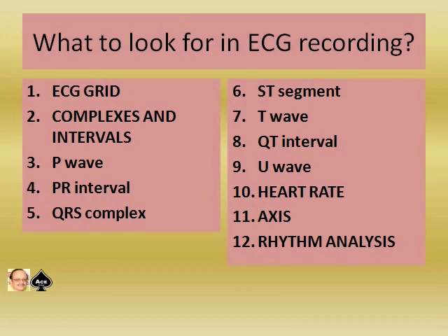These are very important in the initial stage itself, otherwise you will be wrongly interpreting. And if possible, please note down the main clinical features also, so that you have some idea of what clinical condition you are looking for.